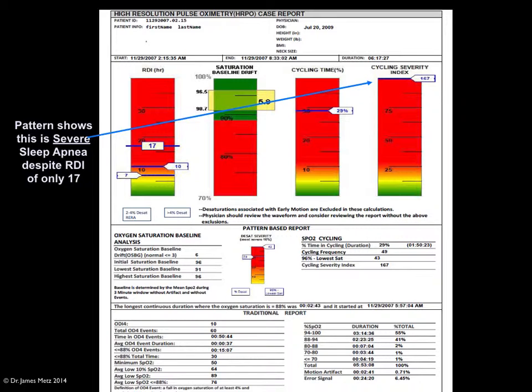Now, what I do is when I see one of these, I talk to patients about the difference between CPAP and an oral appliance. You can pretty much rest assured that many sleep physicians will not bring up an oral appliance. So this is your opportunity to bring up an oral appliance and say, we may be able to do something here. But if you take on a case like this, then they need to go back to the sleep physician once you have it adjusted and have what's called a clearing study done. The clearing study shows that you actually relieved the apnea to the satisfaction of the sleep physician.